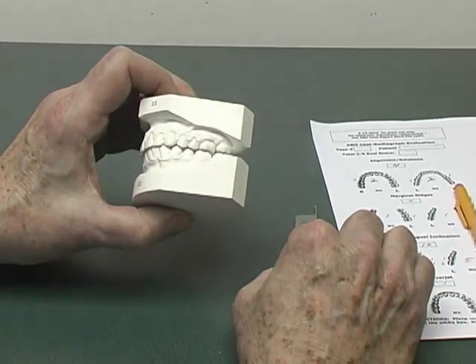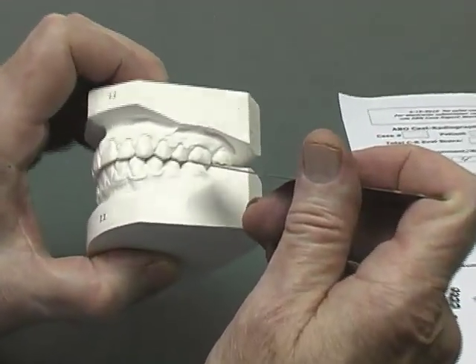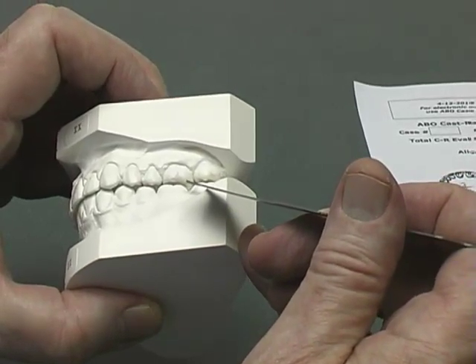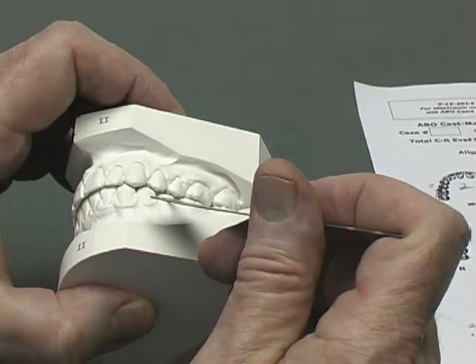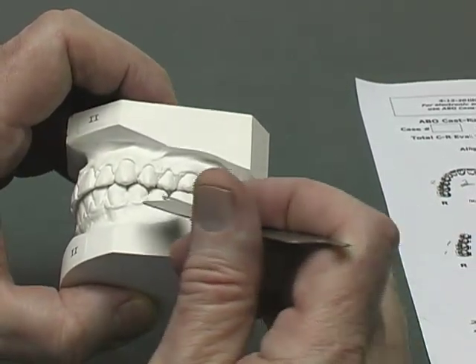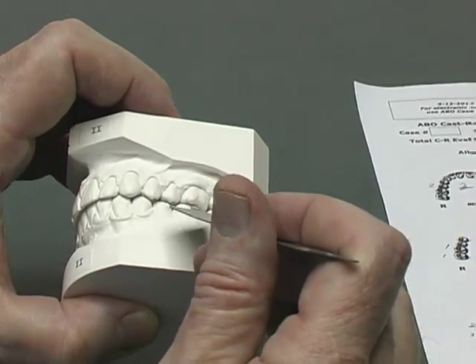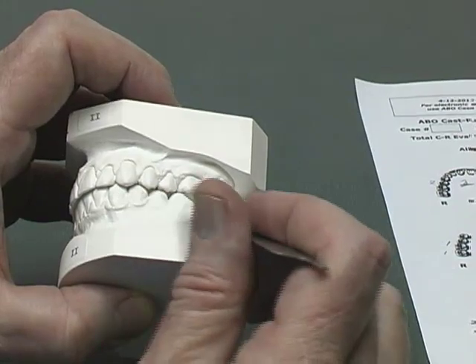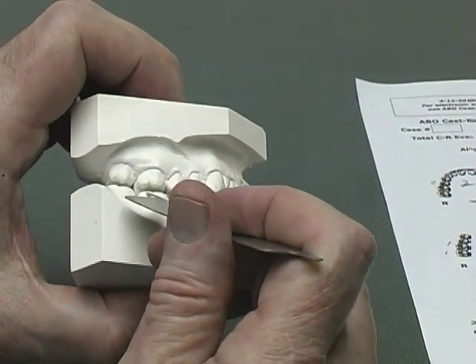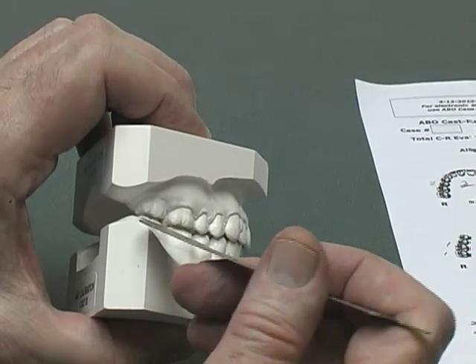With occlusal contacts, keeping the casts occluded, pick up the casts and examine the right and left sides from the facial. The first half of the measure is for the contacts of the mandibular facial cusps with the occlusal surfaces of the maxillary teeth. I place the half millimeter side of the gauge between the contacts. Everything appears to be contacting on the left side. On the right side, when we get to the second molar, it looks like there is a gap or a space there.